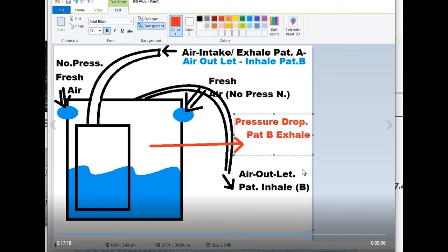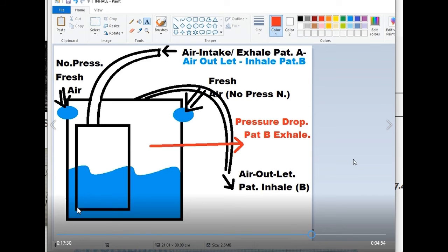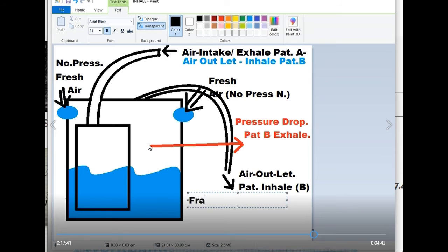Also wenn hier der Druck fällt, dann zieht es die Luft wieder rein. Das ist irgendwie logisch. Has to be solved with valves from in and out, fresh air, not fresh air. But basically, the magic is doing all this with fluid that can actually be water. And there is no fog or anything in between because the water is not boiling, so you don't get an embolism or anything like that.